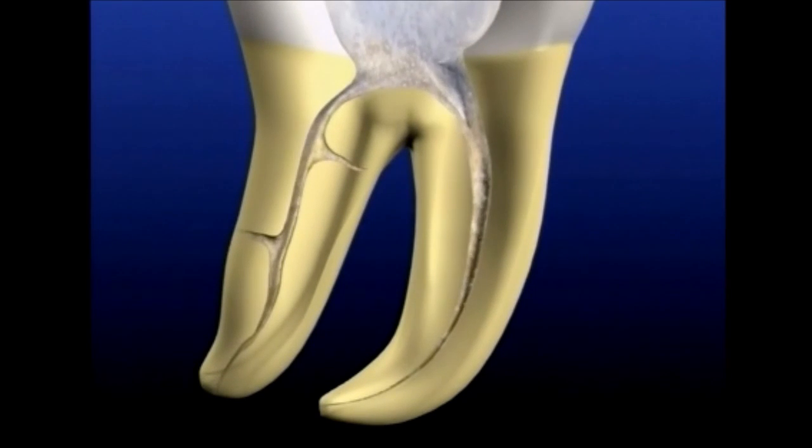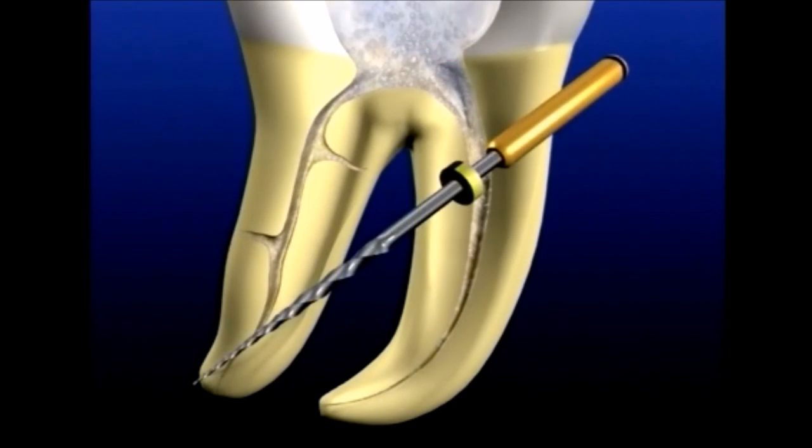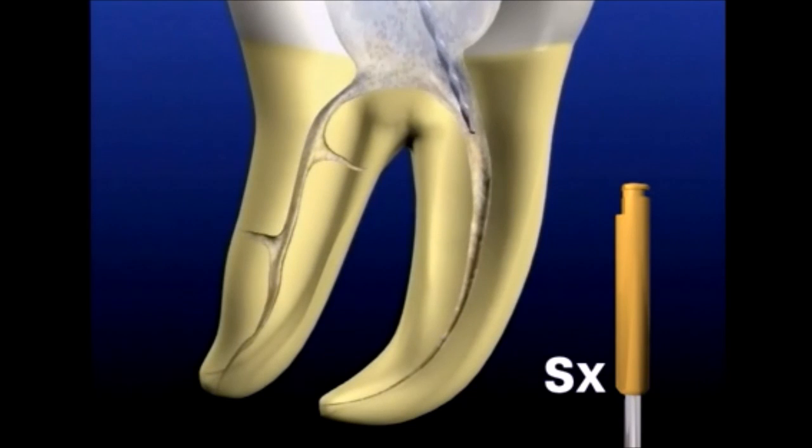Clinicians need to recognize that the reason the handles of the hand files are off axis is because of the internal triangle of dentin. To remove this, the instrument of choice is Shaper X. It's a 19 at D0 and it has a 19% taper over the first 9 millimeters of its cutting blades. The hero part of this instrument is its middle 1/3. That's where we want to cut on the outstroke.